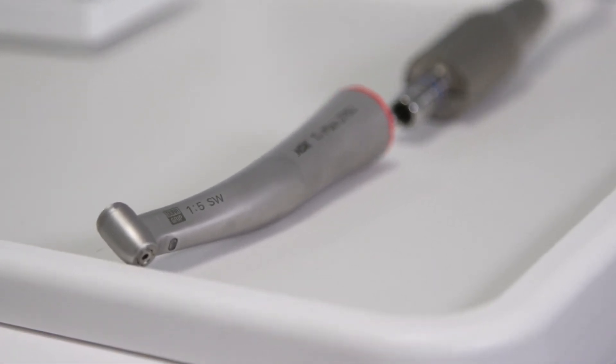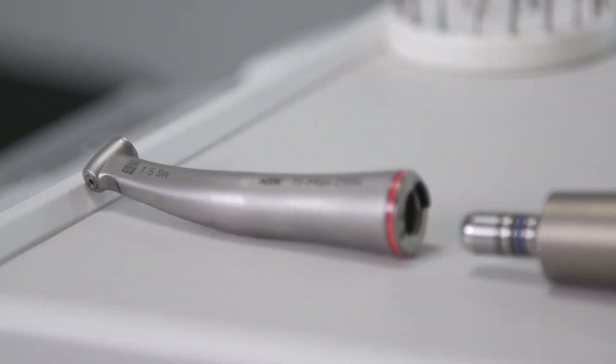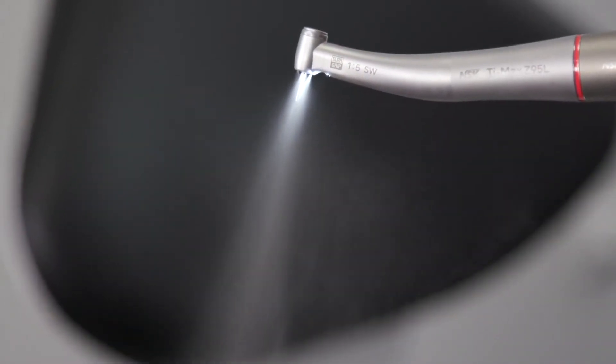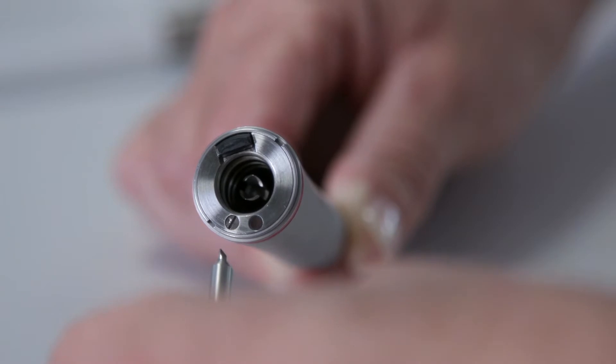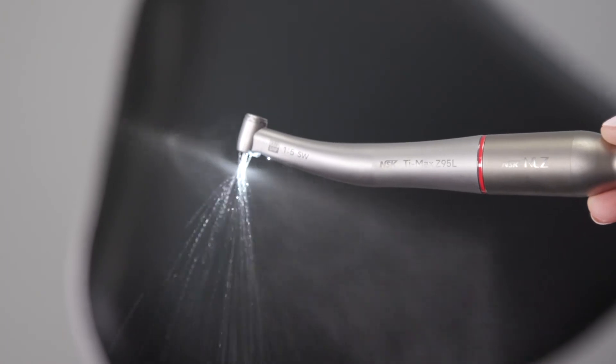For example, 40,000 rpm from the motor becomes 200,000 rpm from the handpiece. Red bands use water and air to cool the handpiece and create a mist spray. However, the Z95L has a switch function which allows you to turn the air off, creating a jet spray that efficiently cools the burr while reducing the spread of aerosols in your practice.